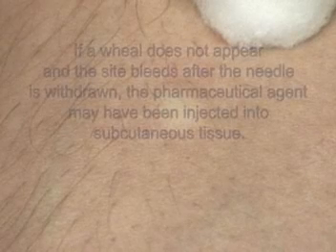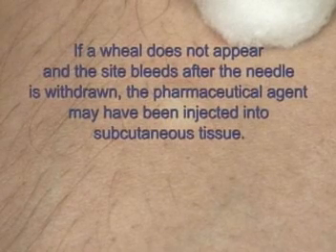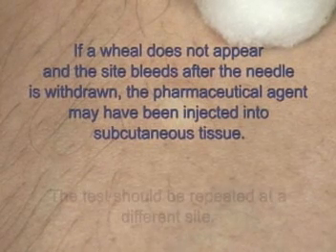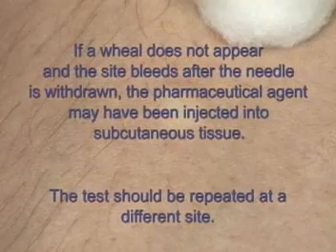If a wheal does not appear and the site bleeds after the needle is withdrawn, the pharmaceutical agent may have been injected into subcutaneous tissue. The test should be repeated at a different site.